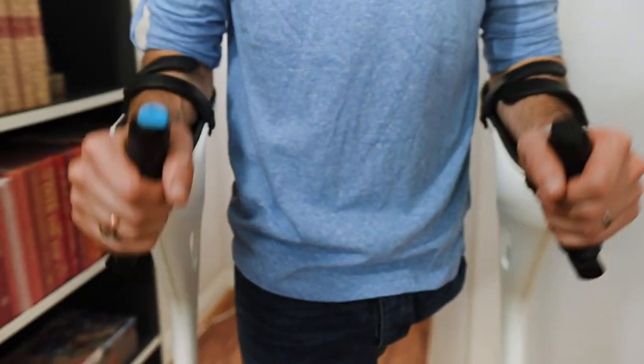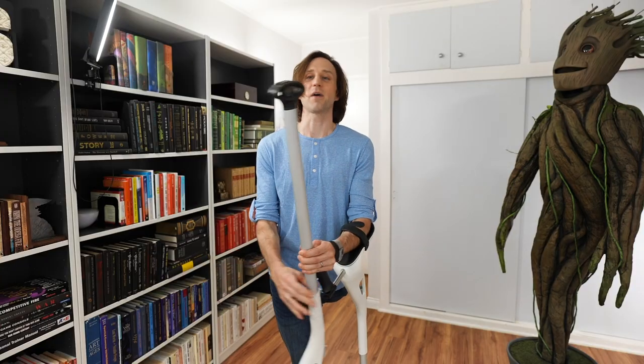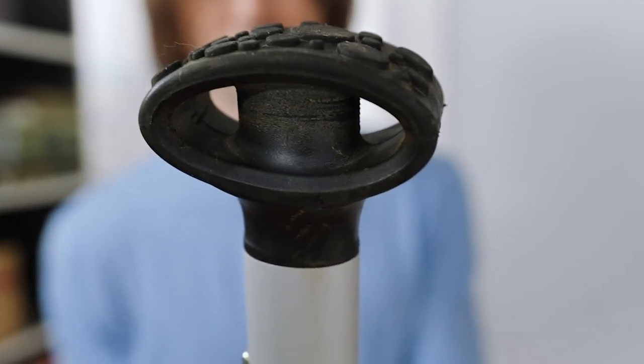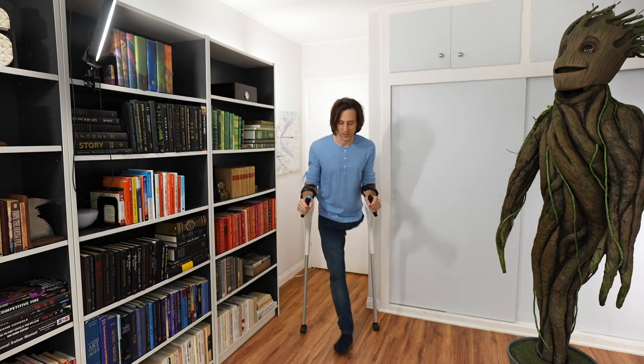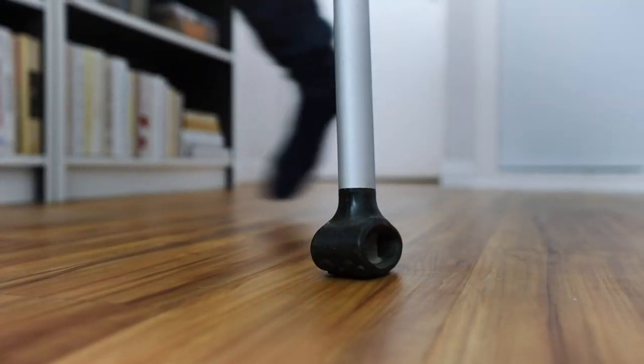Now let's talk most importantly about the walking experience on the crutches, because what are crutches except a walking aid? They have a pretty interesting crutch tip — I haven't seen a tip quite like this before. It is curved, which allows you to kind of roll across on each step, keeping you balanced and stable. So if I'm taking steps towards you, you can see I roll across, roll across on the tips.